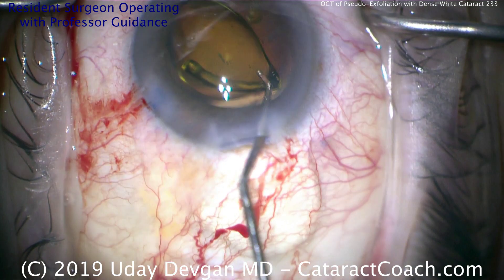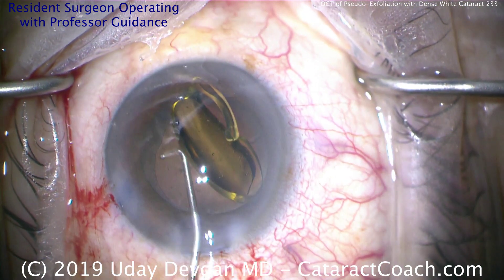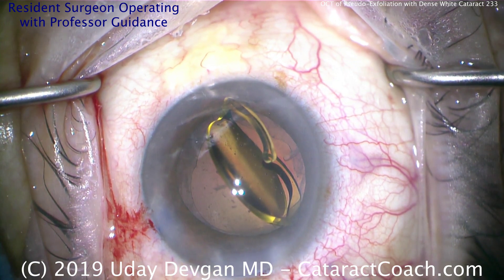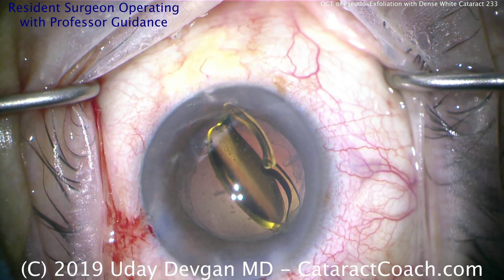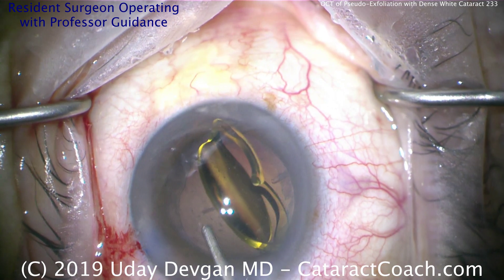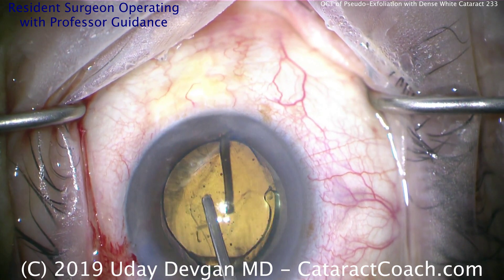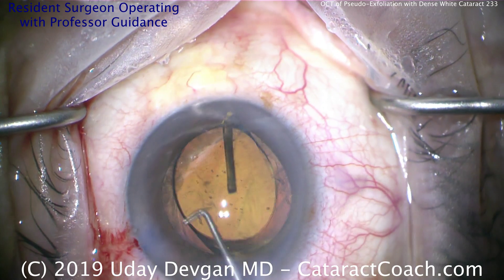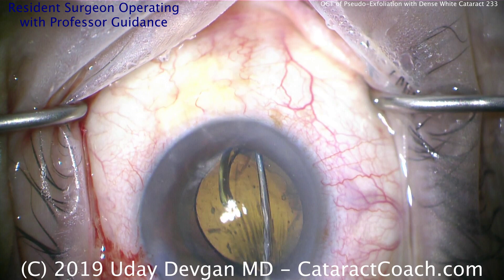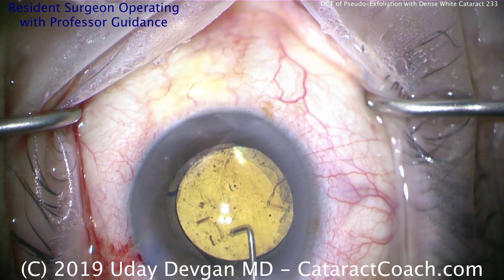That's incorrect — that's better. Yes — get that lens in the correct anti-S orientation. Let's get a little more viscoelastic in the eye and another instrument, a chopper, to get the orientation correct. Very important — let's get this thing flipped over. That looks good — that's the anti-S, that's what you want. Look how the first haptic, the nasal leading haptic, is like the number 7, and the trailing haptic is like the capital letter L. So overall the haptics and the optic make the opposite of an S — the anti-S. That's perfect.